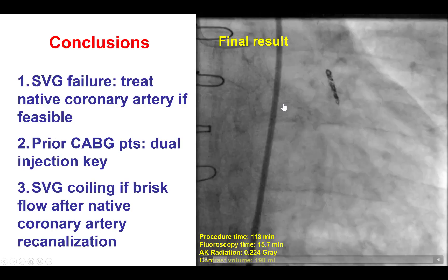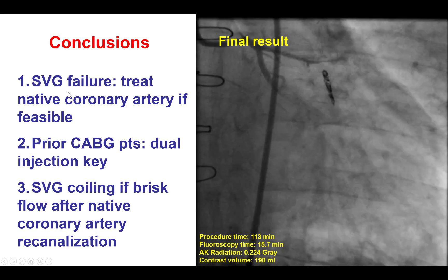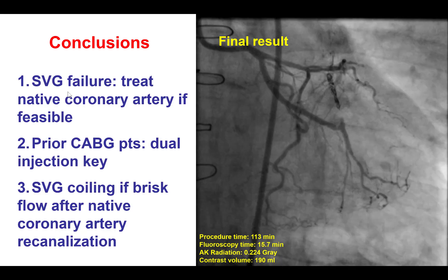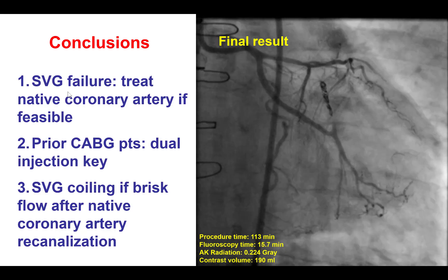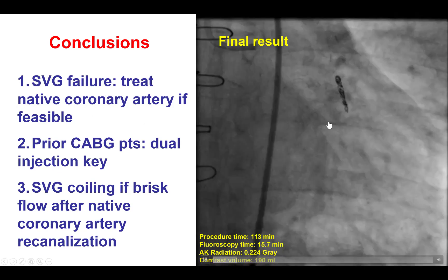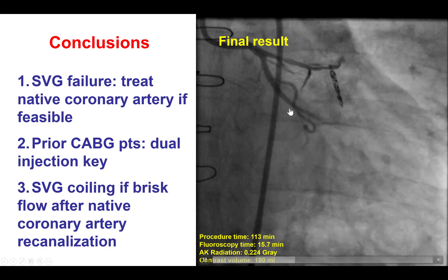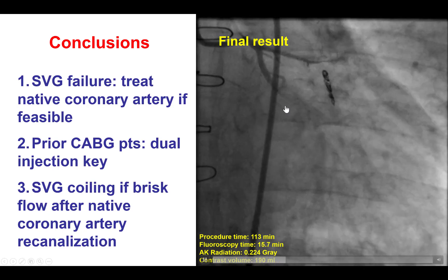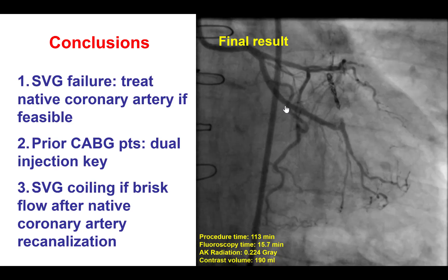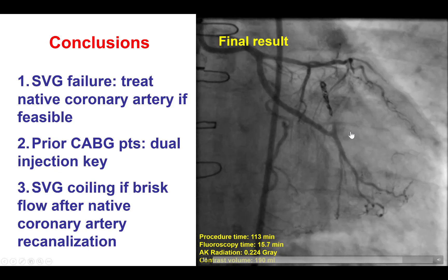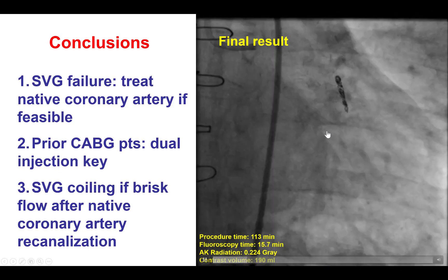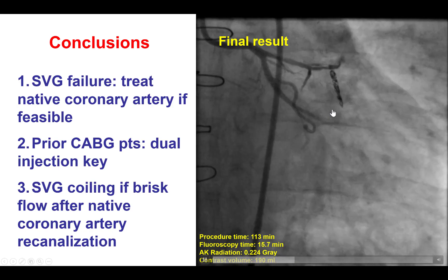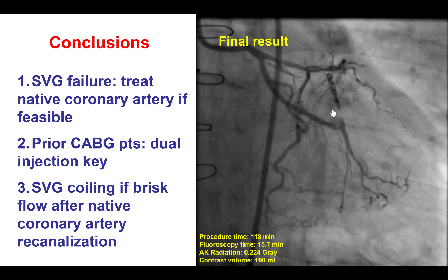In summary, there are several lessons from this case. First, when a patient presents with SVG failure — especially recurrent SVG failure — it is always preferable to treat the native coronary if feasible and not very complex. Sometimes one cannot understand this unless dual injection is performed, so there should be a low threshold for dual injection in prior bypass graft patients with SVG failure. Third, once the native coronary is re-canalized, one should check for brisk competitive flow through the saphenous vein graft, and if present, many operators recommend coiling the vein graft to minimize the risk for stent thrombosis of the recently placed stents.